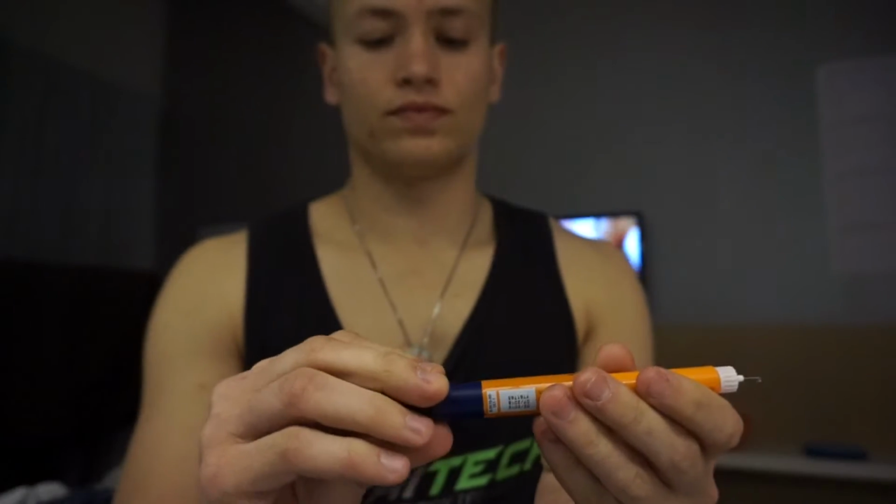Alright, so 7.1 is not where you want your level to be, it's slightly above. But I did only eat an hour ago, and it usually takes about 2 hours to get back to where it should be. That's the normal level it rises to when you eat carbohydrates, I guess. So I'm gonna have 1 unit per 15 grams of yogurt, and that should be it for today. That should be my last injection for the day.